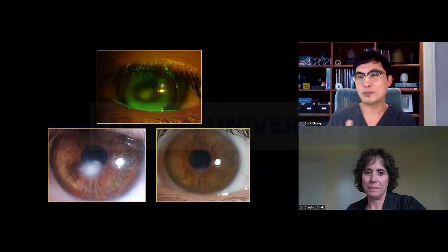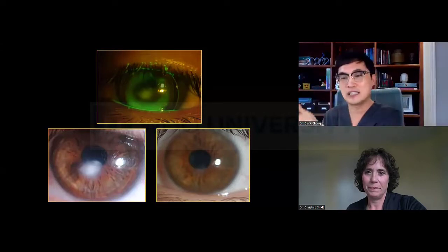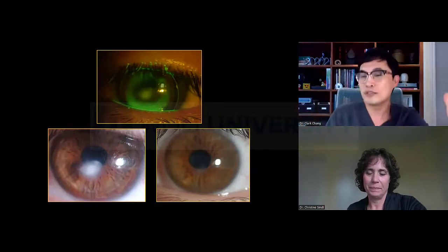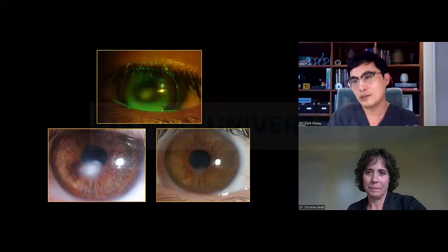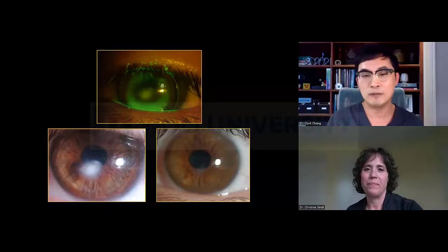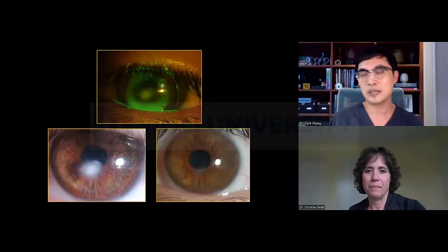And he actually progressively got better from piggybacking. And the vessels, I couldn't find them anymore, so I didn't photograph for you. And his vision went from 20/50 to 20/25. Eventually in a scleral, went another year into it with the fluid protection, and the ecosystem underneath the lens improved his cornea. He actually was so clear I couldn't photograph anything for you. So that's why I don't have the next set of photos. And he did reach 20/20 minus, which was pretty amazing for him. It spared him from having to undergo transplant, or at least greatly defer the need for that.